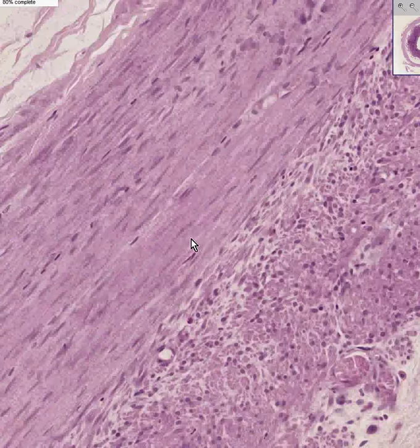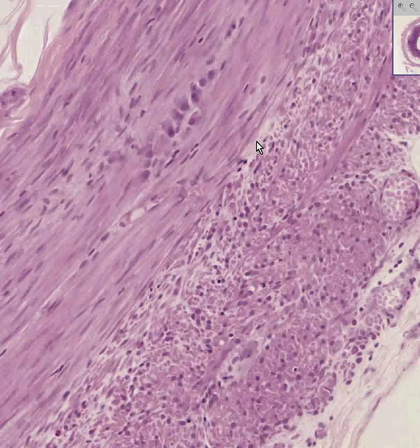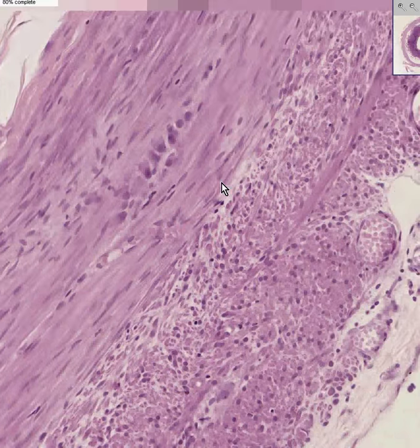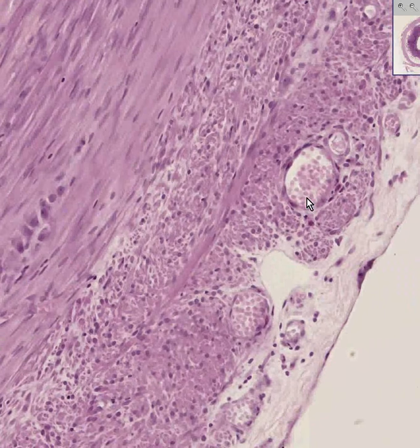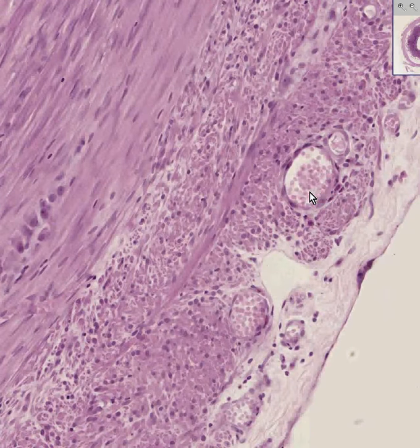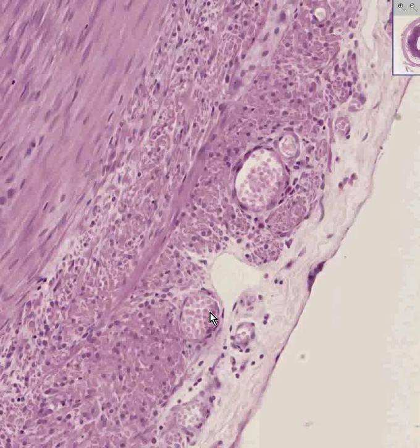But I guarantee you, if we drove around this entire appendix, we would never see any significant infiltrate of inflammatory cells. We do, however, see some dilated blood vessels in the serosa, which is quite common, even secondary to surgical manipulation. But there is no infiltration of inflammatory cells into the muscular layers.